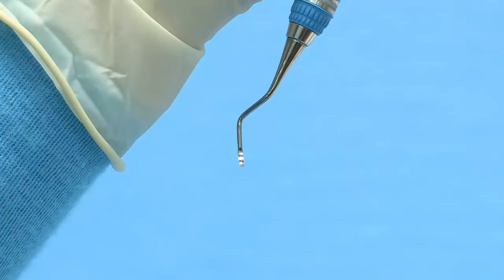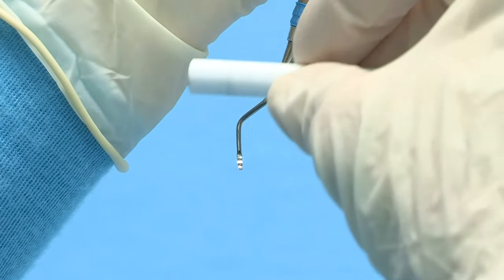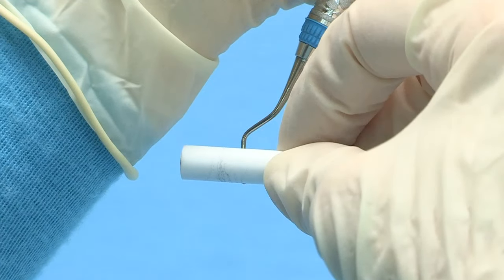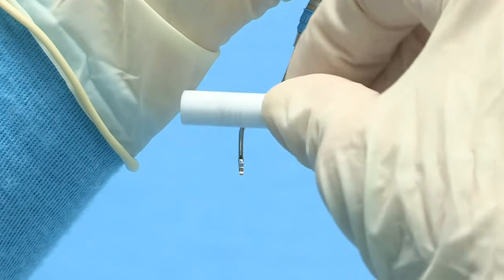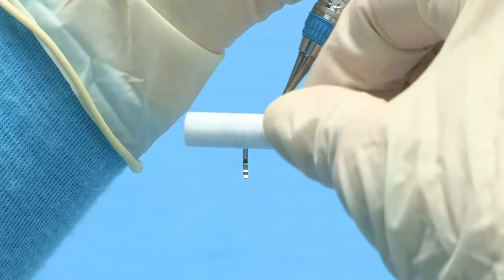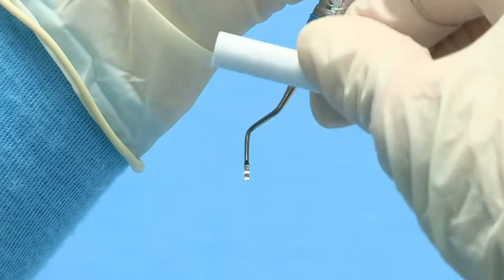To finish sharpening a universal curette, hold the blade at eye level with the terminal shank at 12 o'clock with the toe pointed toward you. Position the cylindrical stone along the face of the instrument at 3 and 9 o'clock. With slight downward pressure, roll the stone along the face from the heel to toe, removing any wire edges.